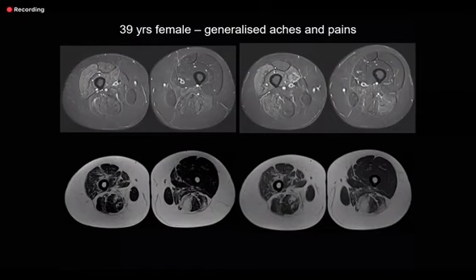If the weakness is around the pelvic girdle or the shoulder girdle, whatever. Initially there will be high signal on the STIR sequence, and T1 will be irrelevant, if it is an acute case. Gradually, when atrophy starts developing, there will be fatty replacement, and the signal on STIR will decrease. So high signal on T1 will be because of fat replacement.